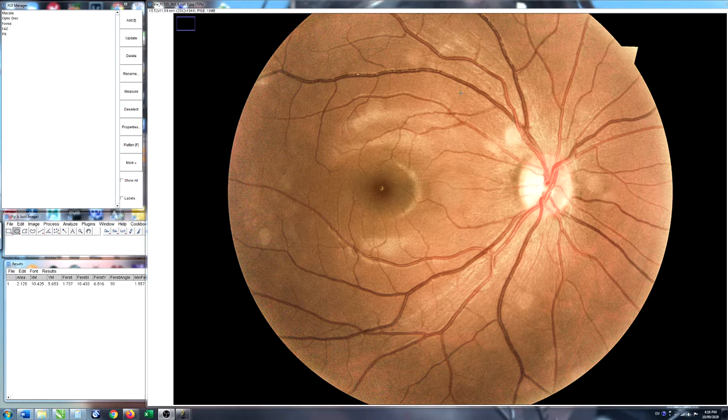You can also see all the blood vessels coming out, which are very obvious. When you go to an ophthalmologist, the first thing they do is look at those blood vessels and check for any bleeds, weaknesses, or swellings in the wall — they should all be cylindrical and even in diameter. Weaknesses often occur at junctions of blood vessels, so you look around the various branch points.